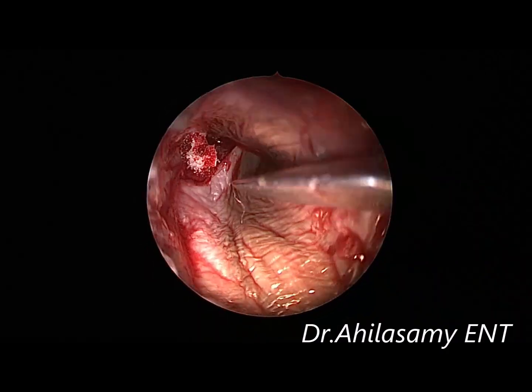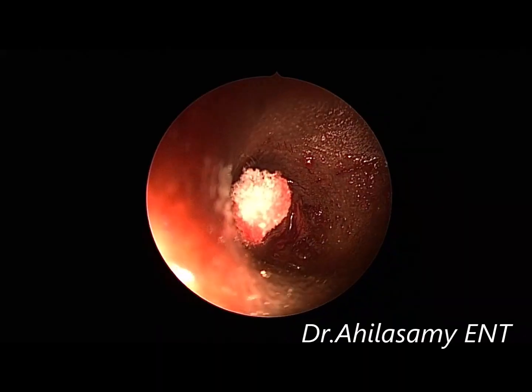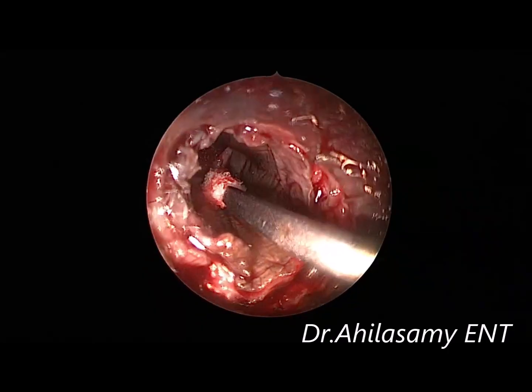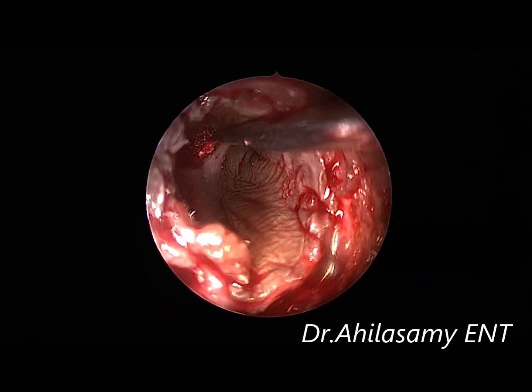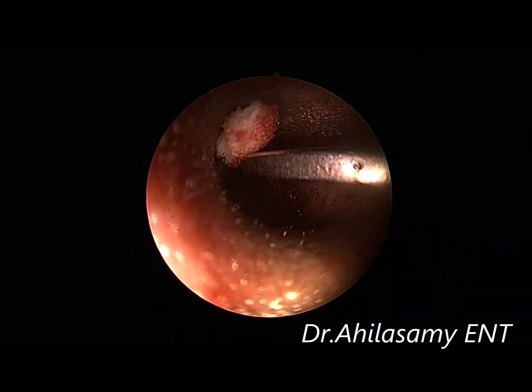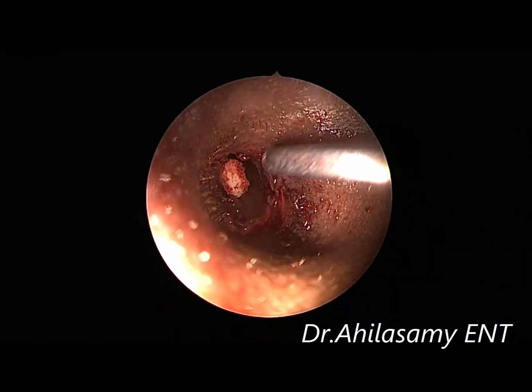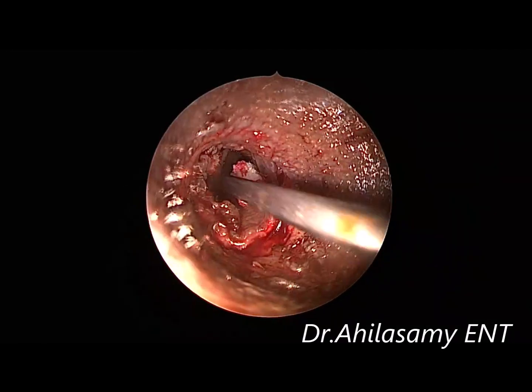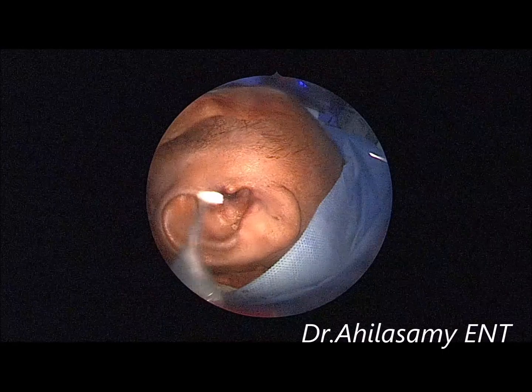More gel foam is placed over the graft and tympanomeatal flap to fill the canal. Finally, I keep an antibiotic-soaked roller pack in the canal and discharge the patient as day care the same day evening. I ask the patient to return after 7 days to remove the canal pack, but I will not disturb the gel foam.